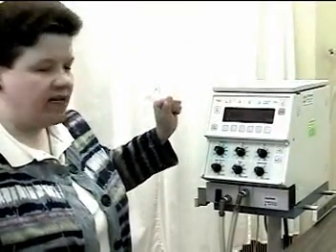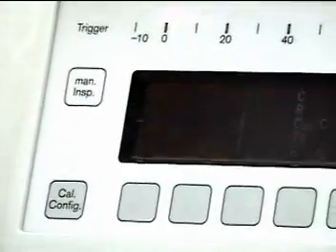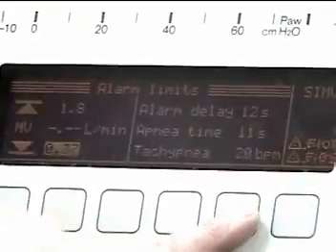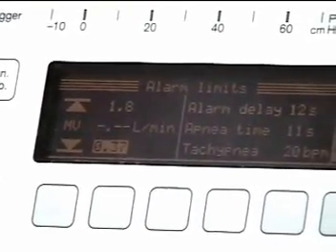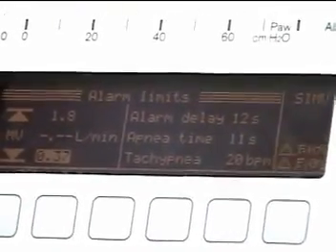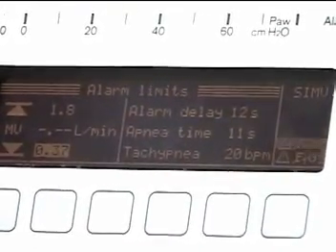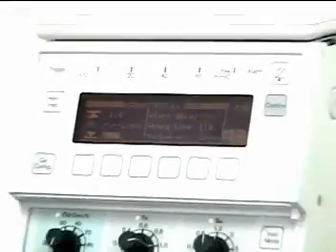The left side of the box shows minute volume with a high and a low value. To the right side, you will see the alarm delay, the apnea time, and the tachypnea setting. We have already talked about how we would set those on other ventilators, and we will use the same ranges as then.